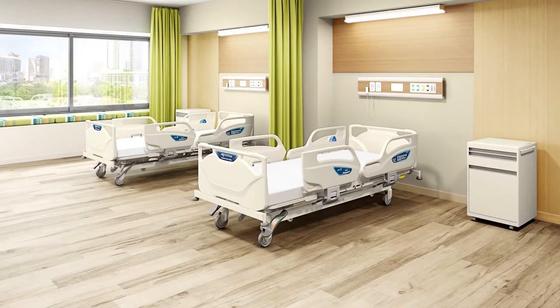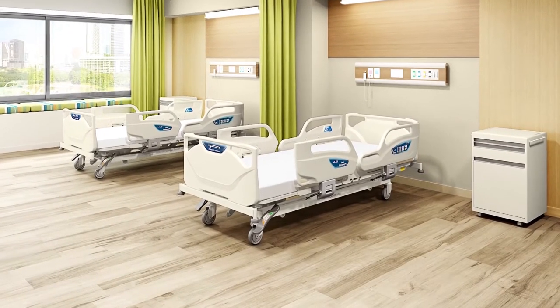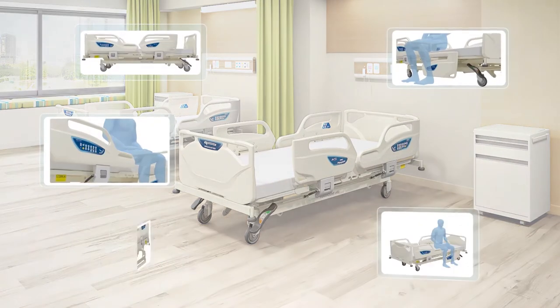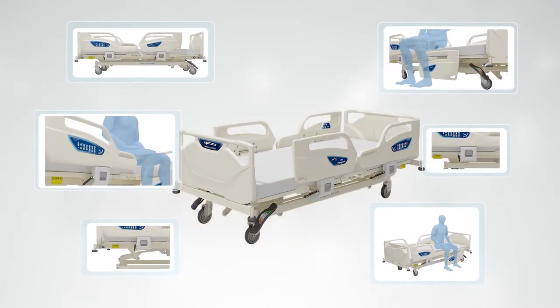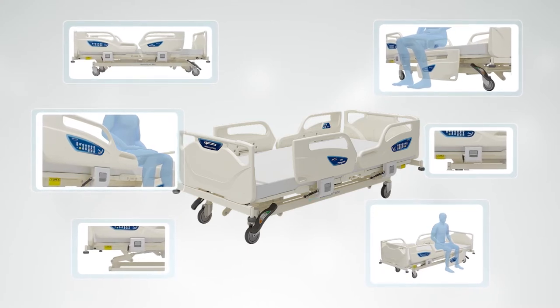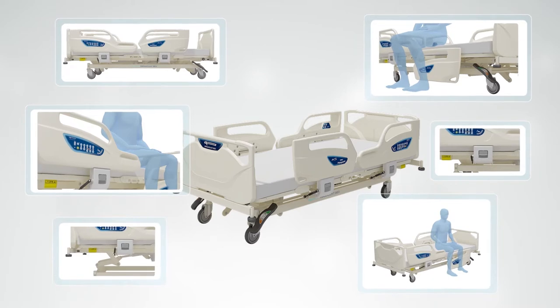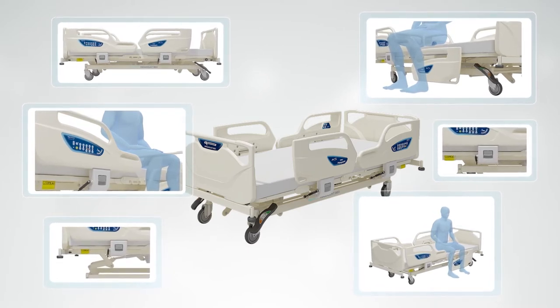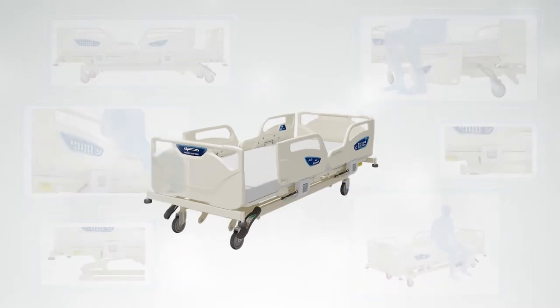All recovering patients need a nurturing environment in which they can recuperate with peace of mind. Placing particular emphasis on safety, the Paramount Bed A5 series is designed to prevent accidents. But not only that, the beds are also designed to be user-friendly, easily cleaned, as well as easily maintained.